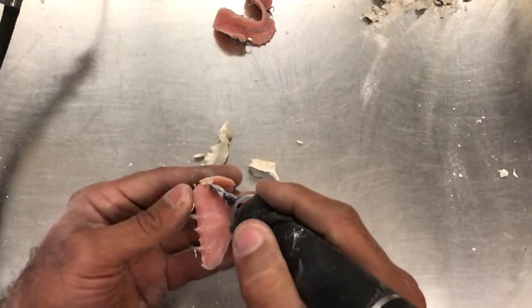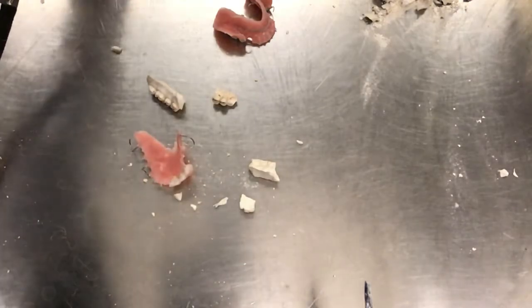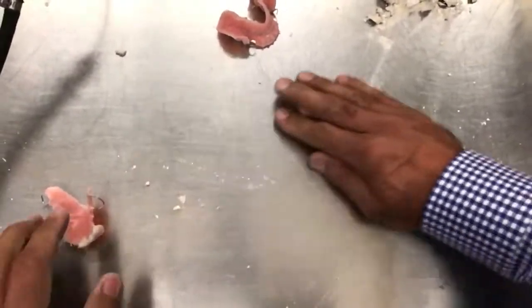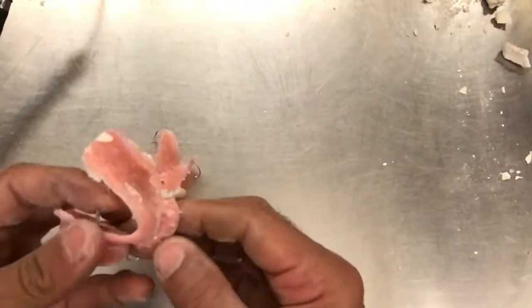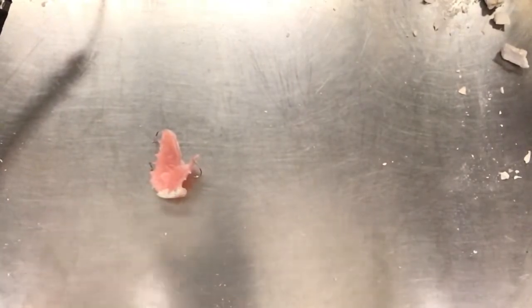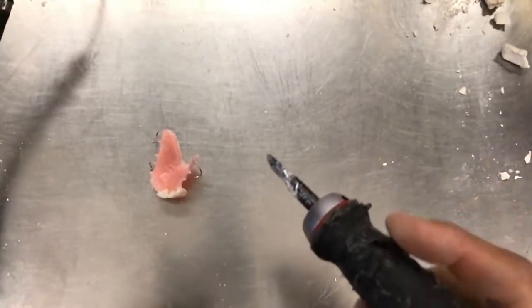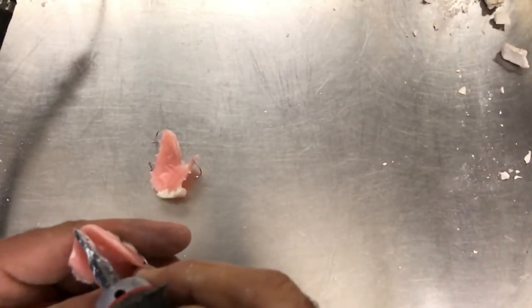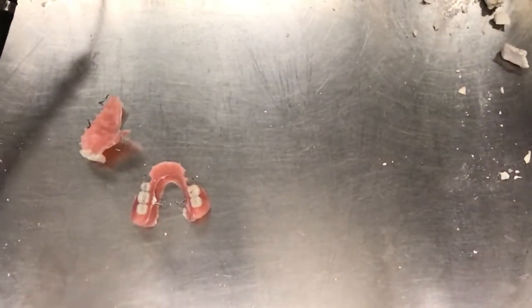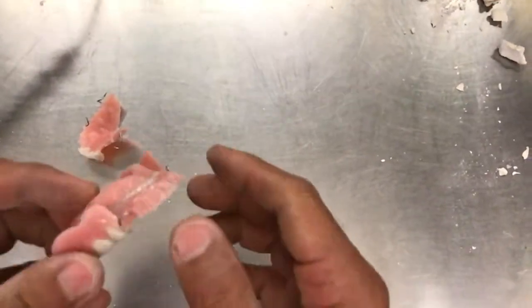Just a little bit of residue in here. So let's take a final look here. A little bit of stone residue here — let me just see if I can chisel that off. Everything looks pretty good.